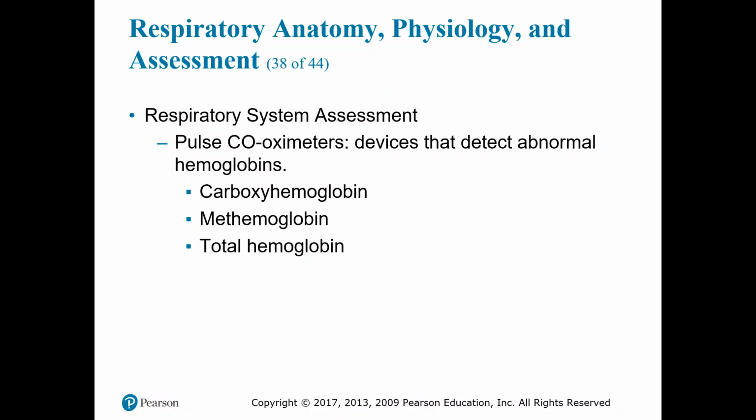Non-invasive monitoring technology is evolving rapidly. Many of the parameters are available on many of the popular commercial patient monitors used in EMS. Like other technology, pre-hospital personnel should not solely rely on monitoring technology. Like I said before, we judged oxygen carrying capability by our assessments, by how much blood was on the floor, how much normal saline we are giving them. Are we giving them huge boluses? Because that's not to replace the blood that's on the ground, because normal saline does not carry oxygen. So we're not expanding oxygen carrying capability. We're only expanding volume to increase blood pressure to get what oxygen we can back to the tissues that need it.